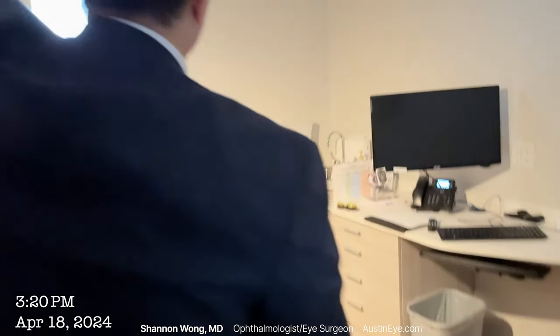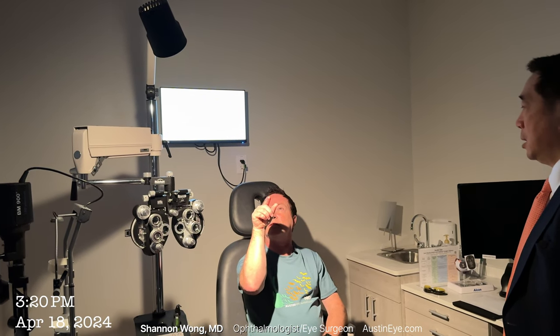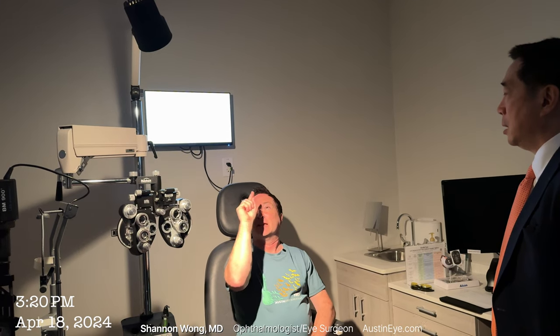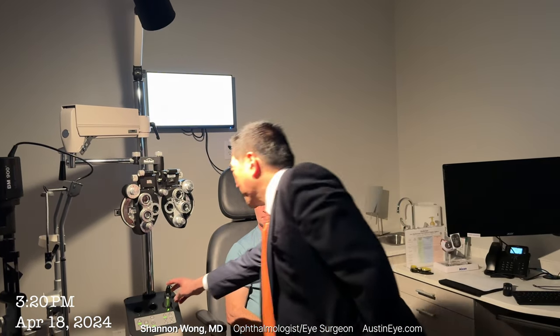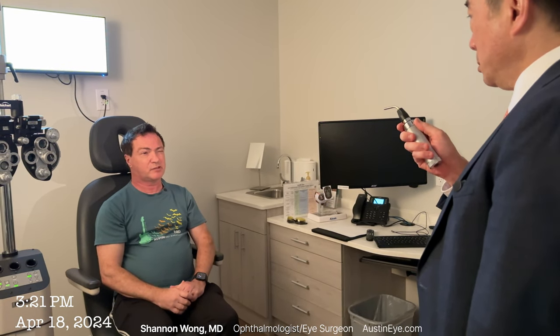What do you notice in this room between your right and left eye? It looks about the same. If I shine a light at you — looking through the Panoptix left eye, there's a little bit of haloing around it. Those are very distinctive concentric circles. And the Clearview eye done yesterday — no distinct halo, no circles. Just like a bright light extending out. Pretty normal.